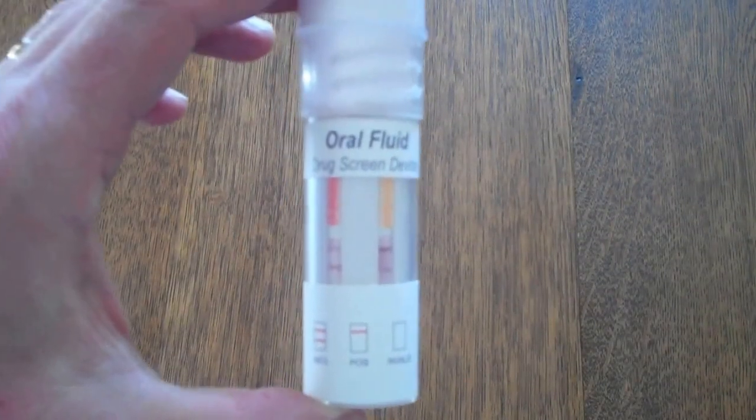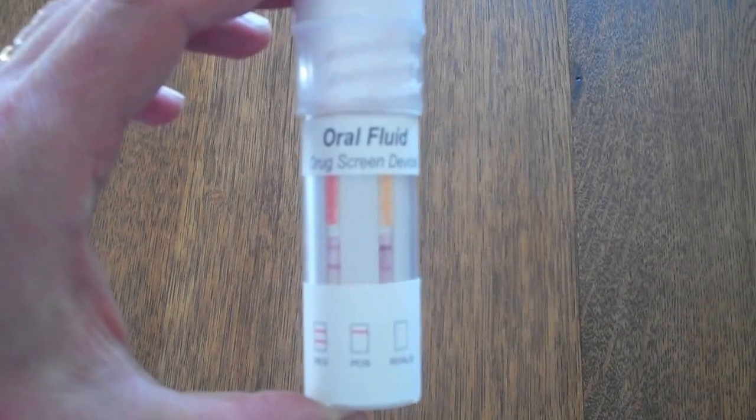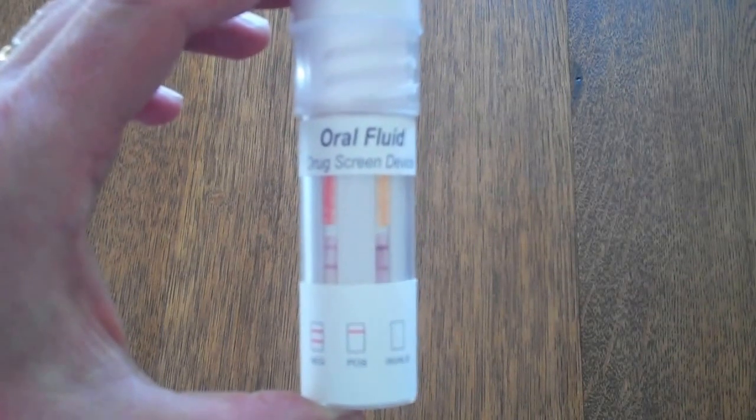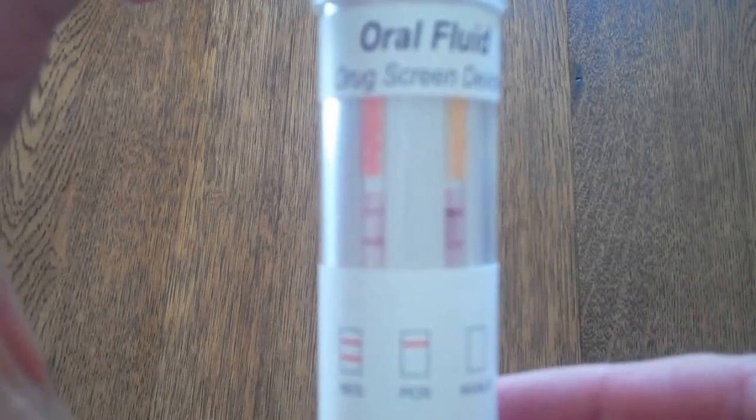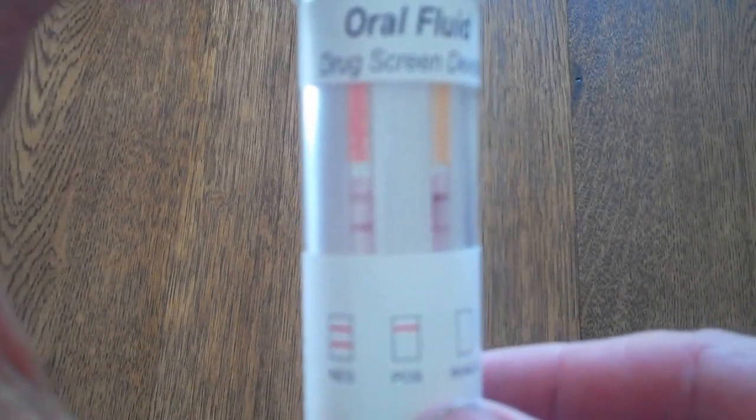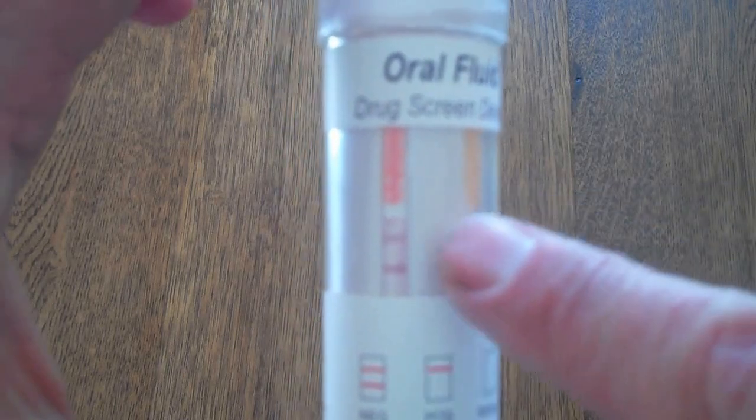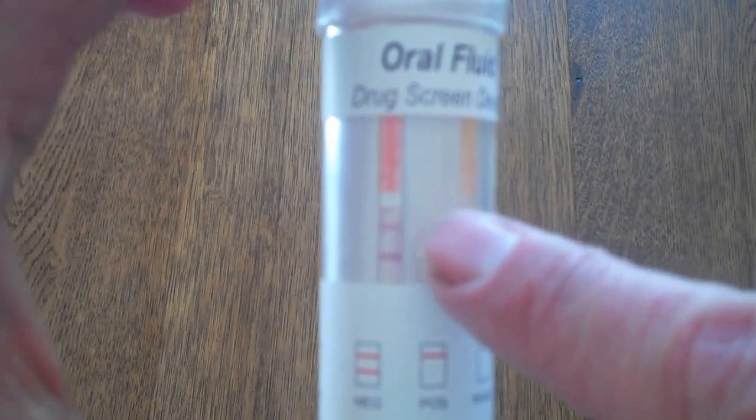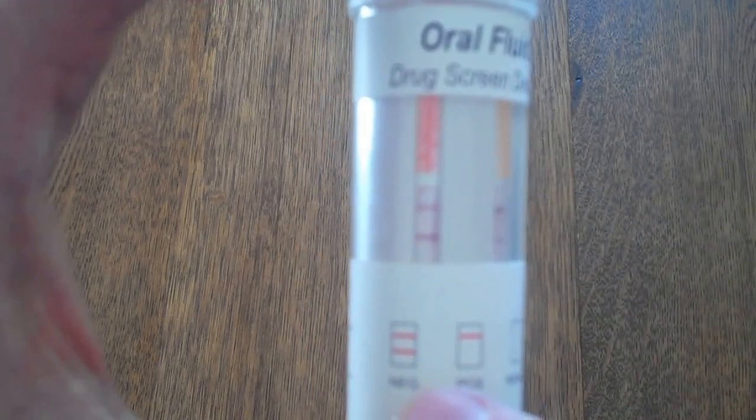Okay, this test has now been running for eight minutes and we can see here, if I bring it close to the camera, you've got a nice clear result there. Control line and a test line, match that to the indicator on the actual device and you've got a clear negative result.